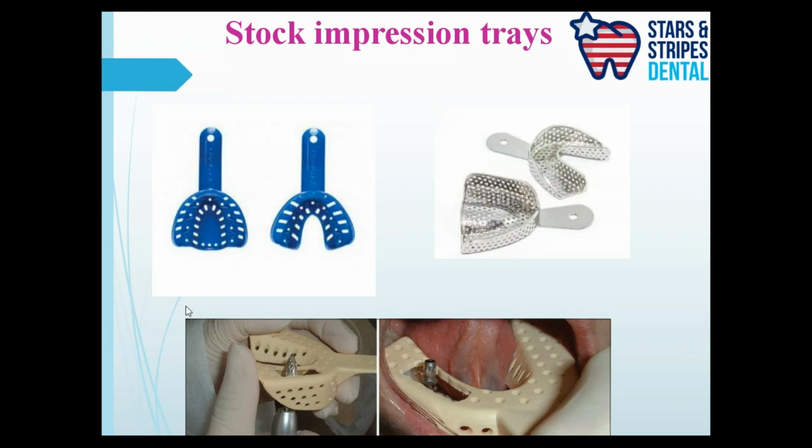Okay. So once you have a good material, you're all set. And as I said earlier, you can go with the stock plastic trays or stock steel trays. Now on this slide down here, you can see I've put a picture where a hole is being drilled through the tray. Okay, and why do we need to do that? It is used for the open tray technique that we will learn as we move ahead. So if you are using an open tray technique for implant impressions, you cannot use the metal stock tray, because you don't want to drill through the metal. Then you need to have either a stock plastic tray or a customized plastic tray.